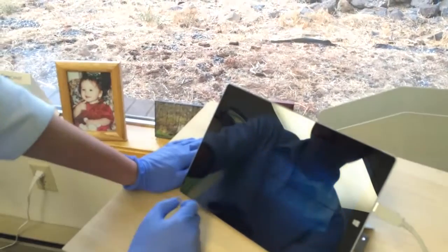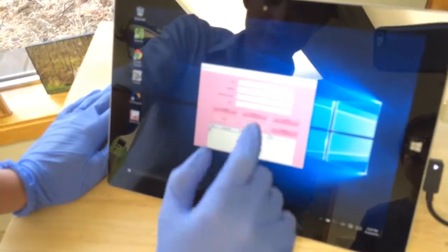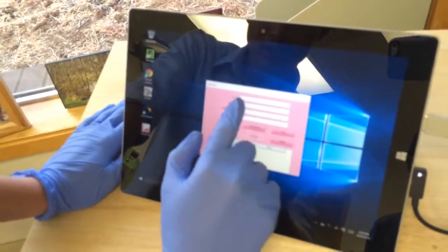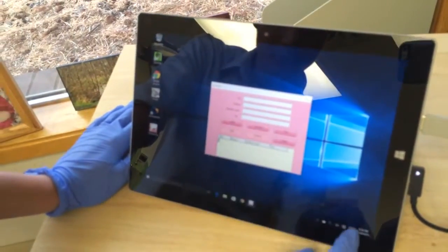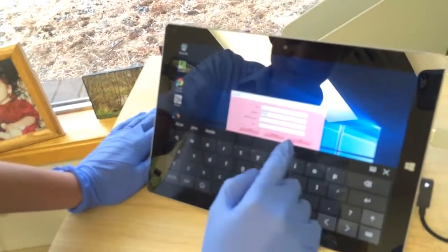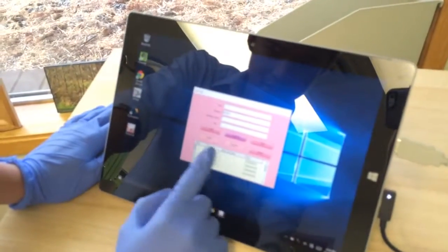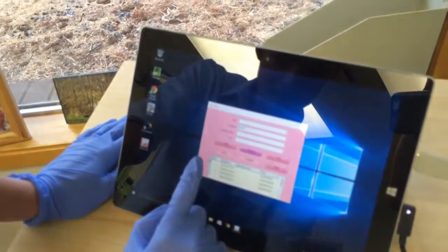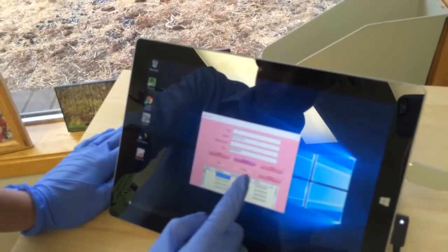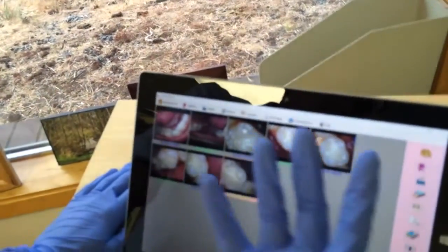All right, so let's go in here. Hit yes. It's the same formula to open it up. Now we search for Jesse's name. I don't remember what his last name was, so I'll just do the first name here. Go ahead and hit search. And there it is right there at the top with the telephone number. We'll go ahead and enter that. And all these pictures come back up.